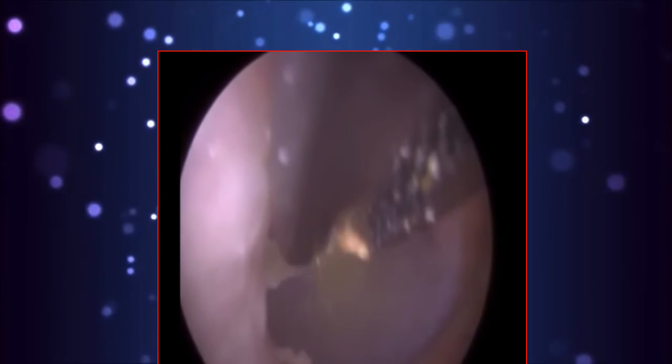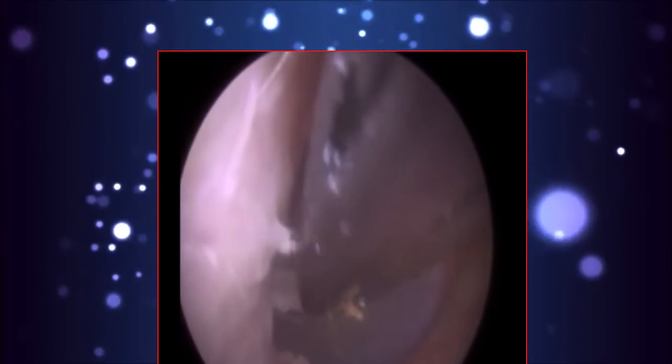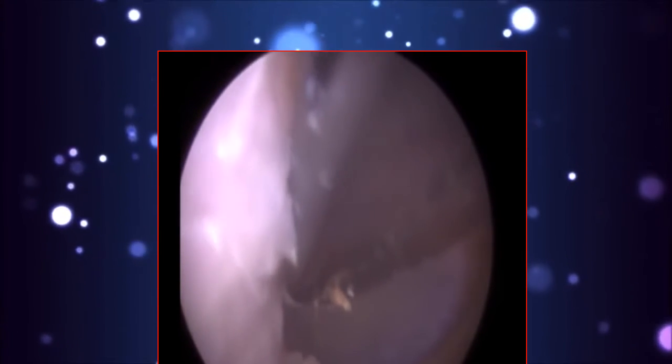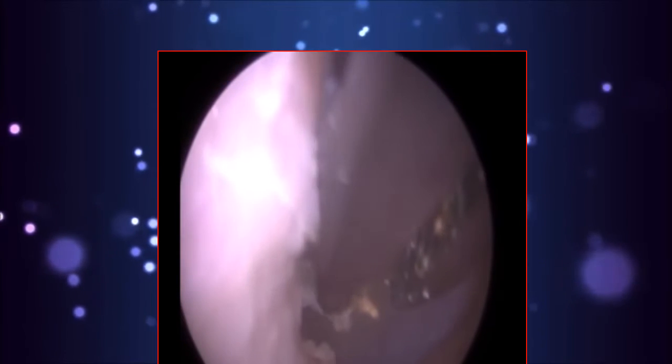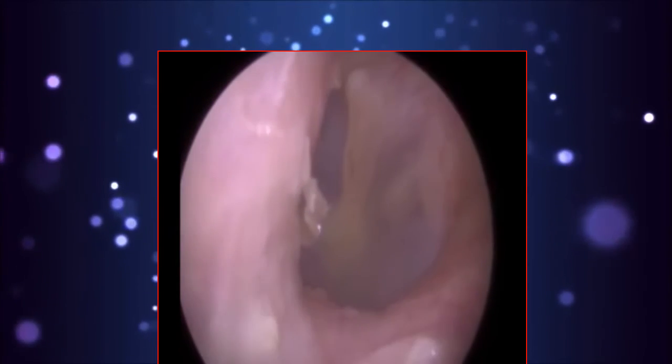So just going with some forceps. These are the fine end shaft 5mm forceps because we're going quite deep. And again, pulling at it, it's not ready to come out. So after this last attempt, I just left it. It's not going to cause the patient any problems. Got the majority of the dead skin out.